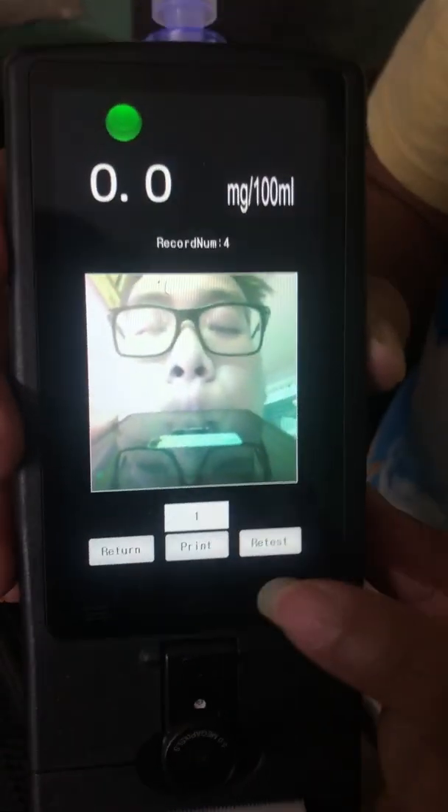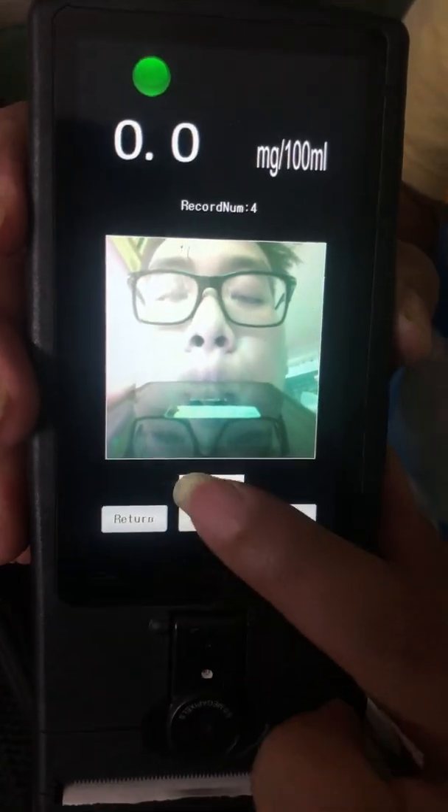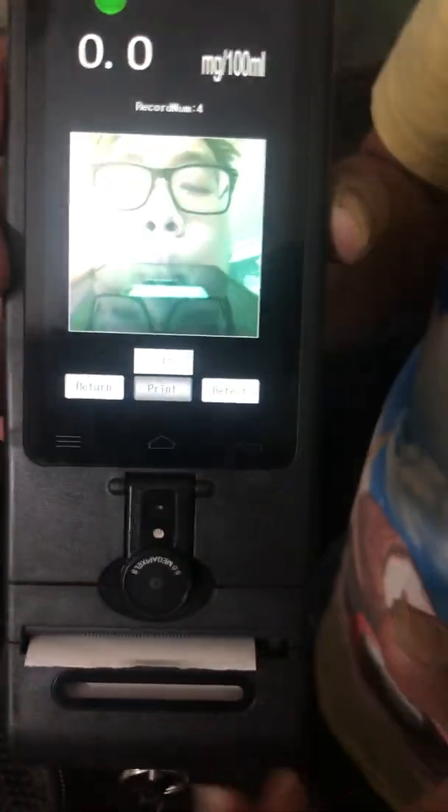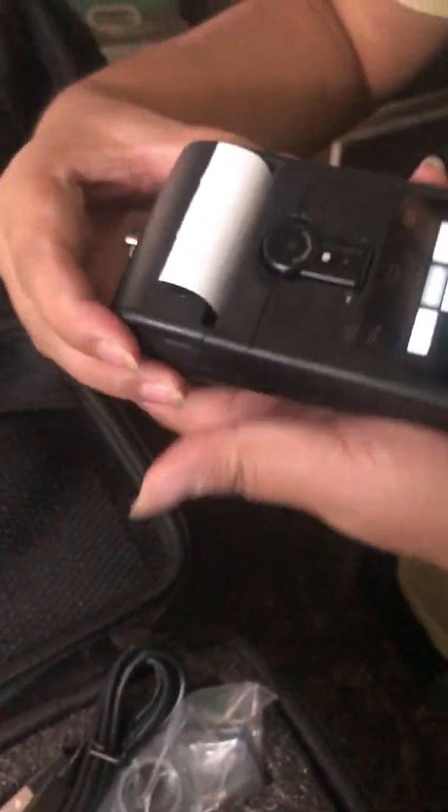Now, if you want to print, the print option is in the middle.